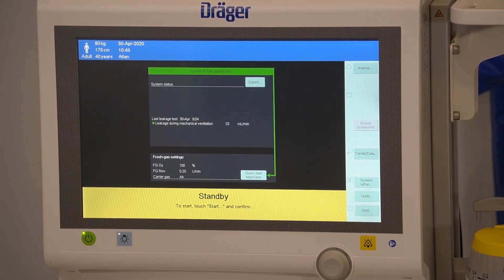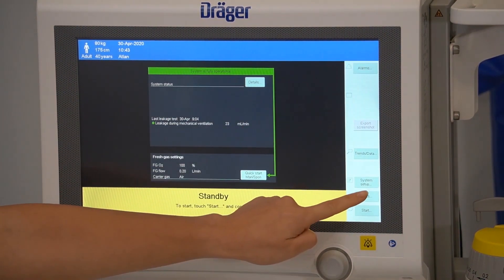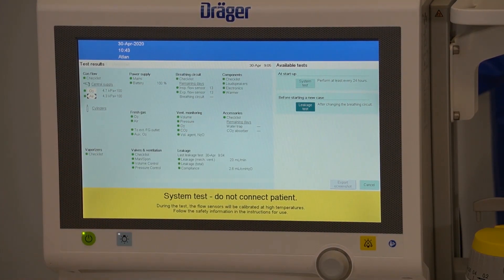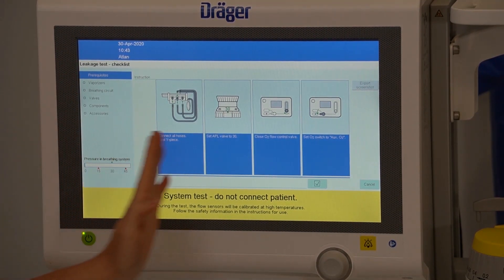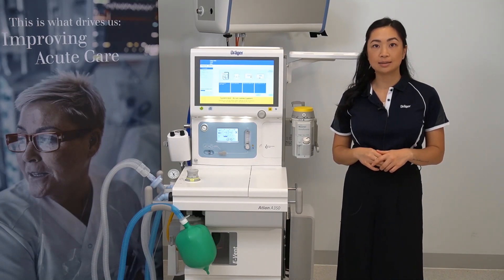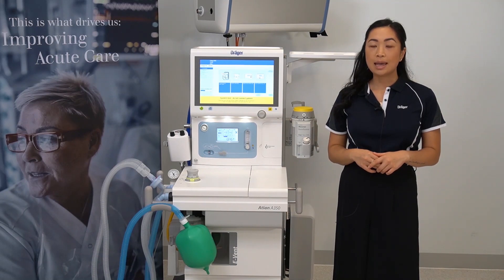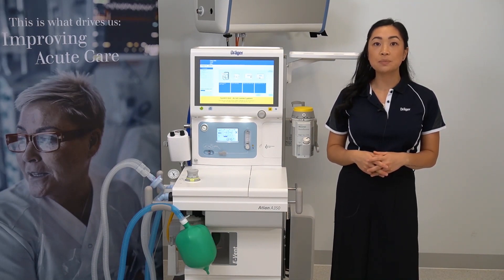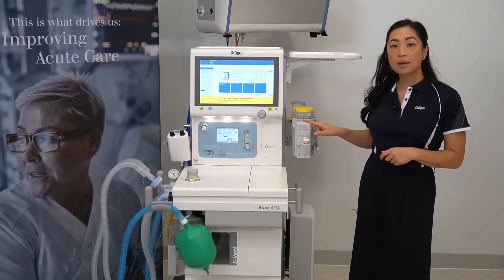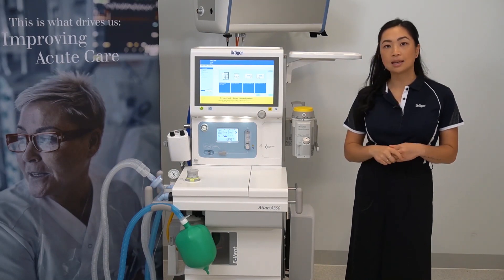To perform a leakage test, this can be accessed from the standby screen. Select the test button on the right-hand side of the main screen and under available tests, you will find the leakage test option. Simply follow the steps listed on the screen. A leakage test should be performed any time the breathing system is modified — for example, when a new breathing circuit is attached or when you exchange the soda lime. It can also be completed following a system test to verify any potential leaks from the back bar — this is done by setting your dial to the lowest setting, then performing your leakage test. Keep in mind you'll need to set the dial back to zero at the completion of the leak test.